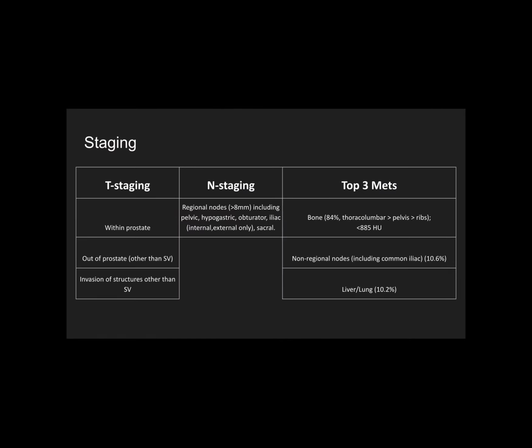Now let's review prostate cancer. Prostate cancer, like breast cancer, is staged using the TNM system, which again is found in the AJCC Cancer Staging Manual. This cancer staging is typically done by MRI, at least the local disease. The extracapsular findings can sometimes be seen on CT.